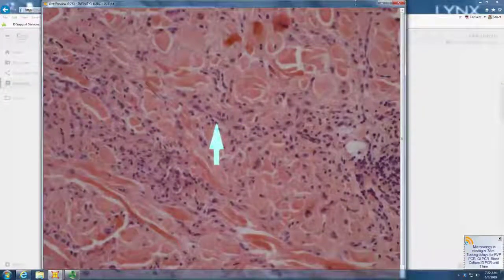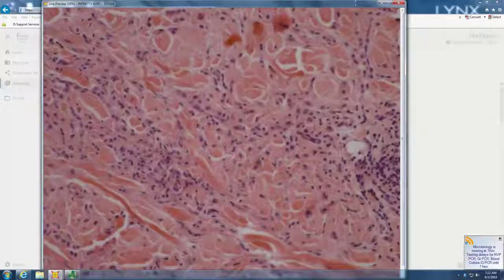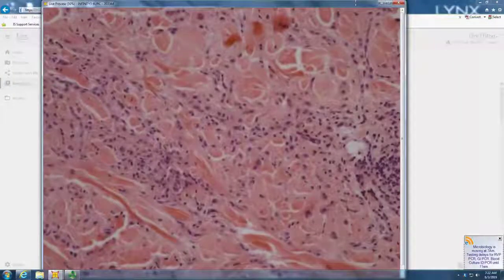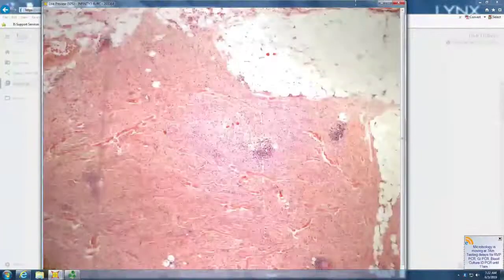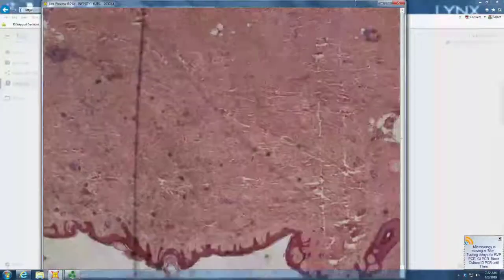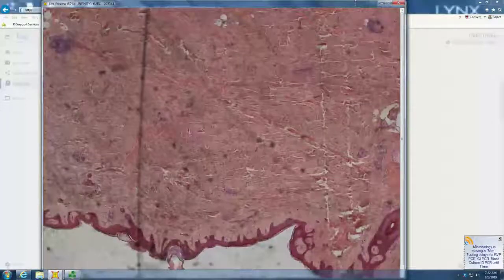Oh. Is it breast cancer? This is metastatic breast, mimicking dermatofibroma at scan. So metastatic breast carcinoma, carcinoma en cuirasse, which can be fibrotic, so mimicking a fibrous neoplasm at scan, looks like a busy dermis, traps a little collagen at the periphery. One clue is, where's the acanthosis? No acanthosis, right? So that's one clue.